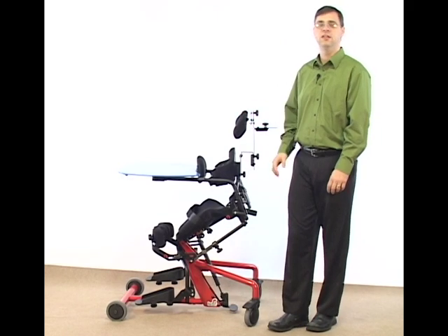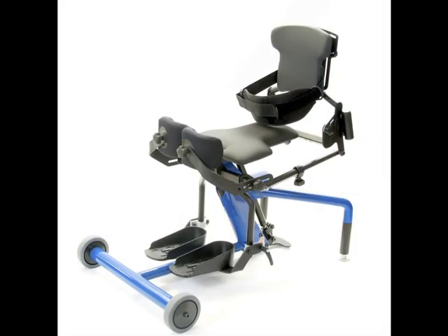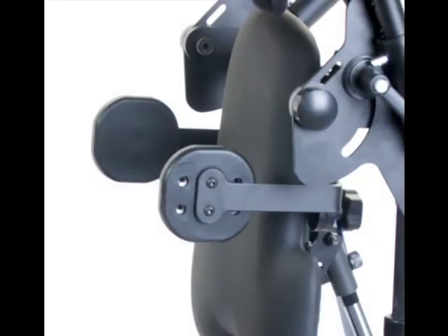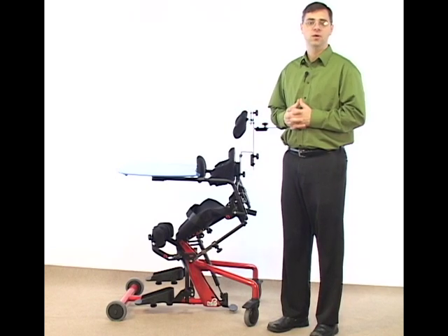We've just been looking at the comfy seat system on the Easy Stand Bantam. If you received an Easy Stand with standard seating configuration or planar seating configuration, there are some additional options including hip supports or lateral supports, and those adjustments adjust in depth and width.